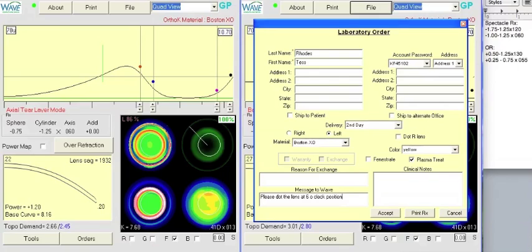And what this does is it helps me see how the lens is oriented on the eye, and see how stable the lens sits. It's going to be counterproductive if the lens rotates significantly on the eye, because we're not going to get a consistent toricity to the cornea, and this will probably be a helpful indicator if you decide to go this route.